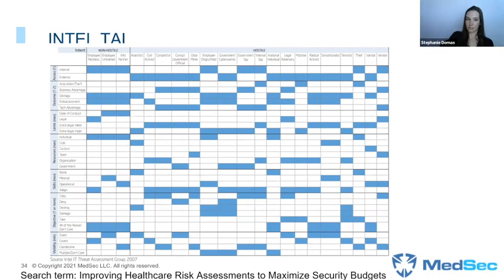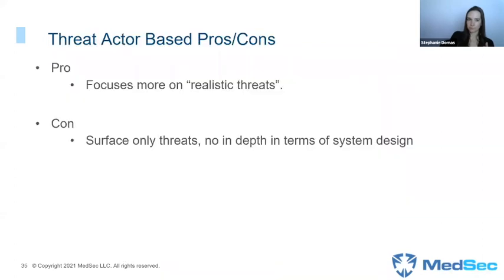So it's built by Intel, and they basically built this actor library. Here are all the threat actors that they perceive to be in healthcare, and this is how they do their threat modeling against their healthcare-based systems. I realize it's an eye chart. I want you to download the document and look through it, ask me questions. But the idea here is just, these are all the actors I need to be concerned about. This is where threats come from.